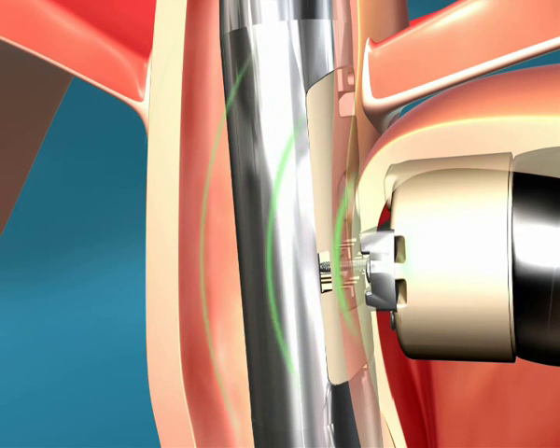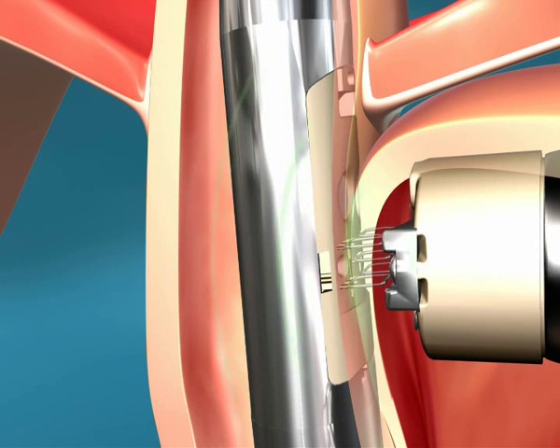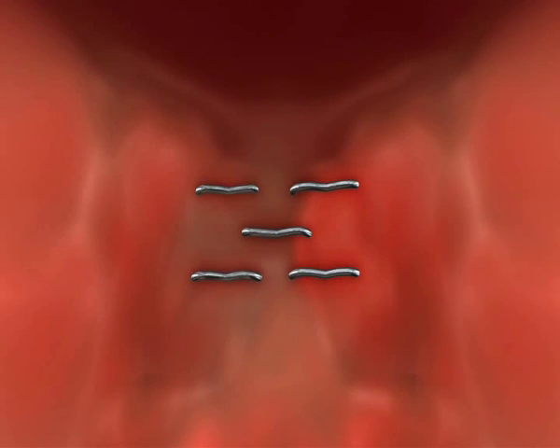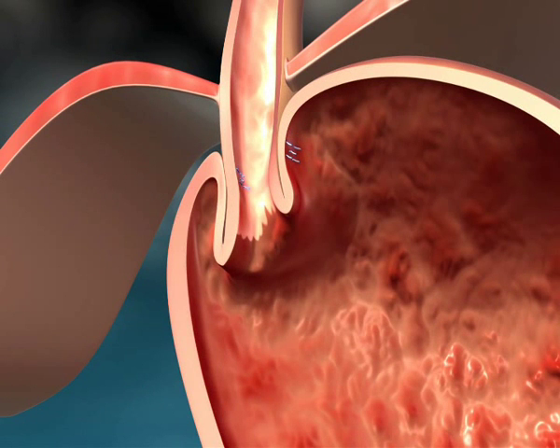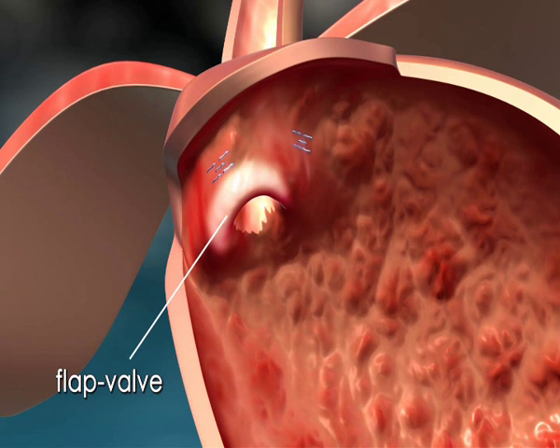The scope is withdrawn slightly. The clips are now visible after clipping the two folds. This maneuver will be repeated on the lesser curve to complete the flap valve.